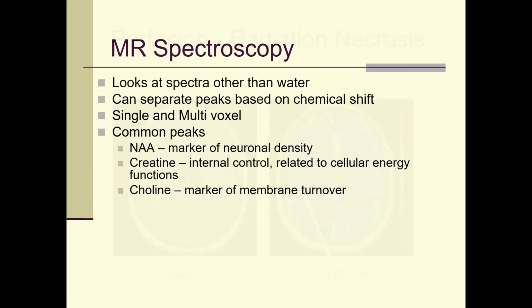Another modality to look at is spectroscopy. Unfortunately, spectroscopy is not as specific, but this looks at the spectra other than the water content.